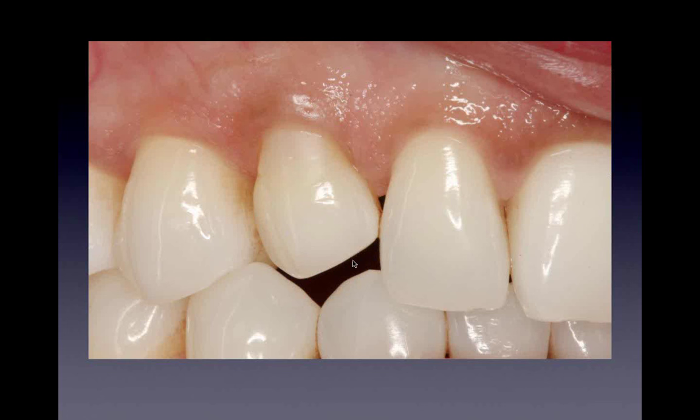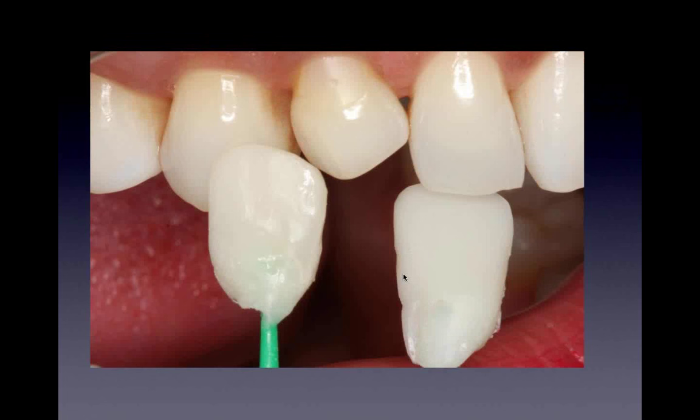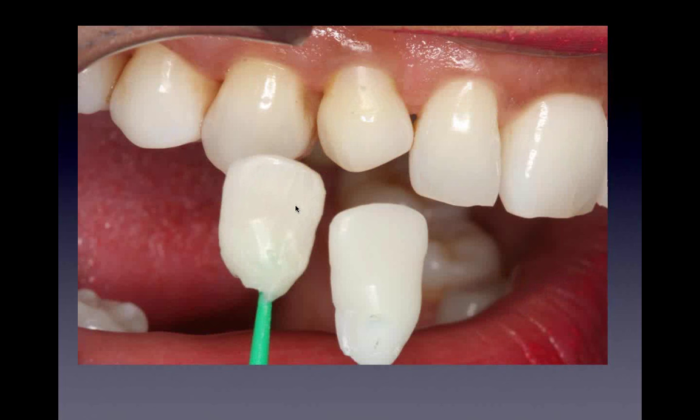So I'm going to do three layers of that color. Here's my B1. Here's my A1. And my A2 is what I'm going to use for the base. So it's about a B1 compared to the composites that I'm using. Here's the A2. It's a little bit darker. Okay, and that's what we look at from that view.